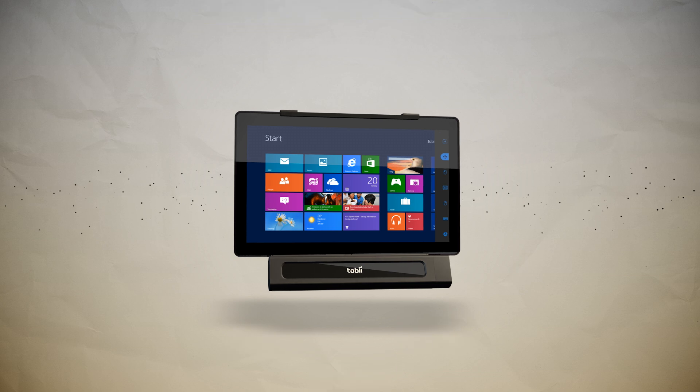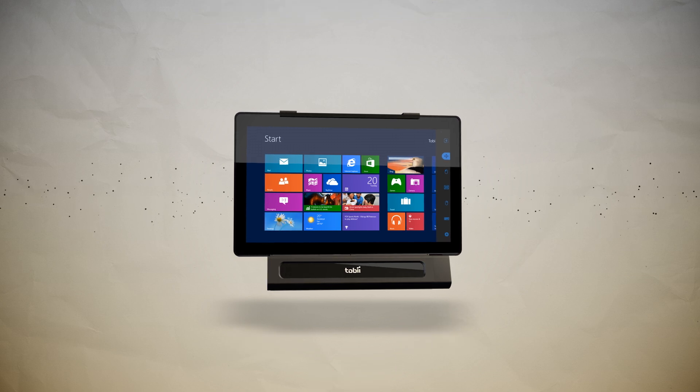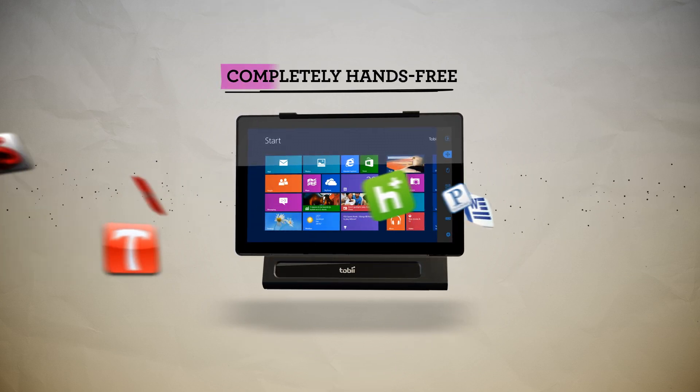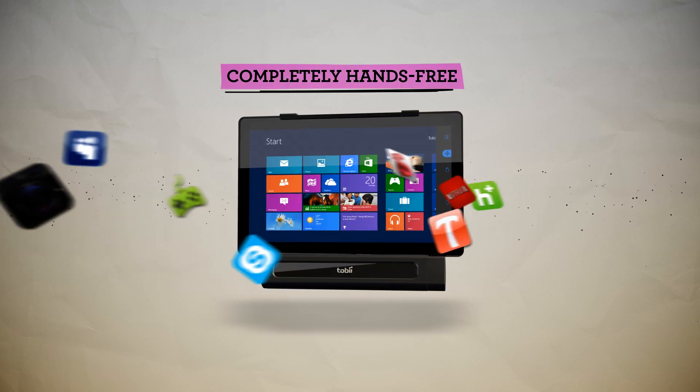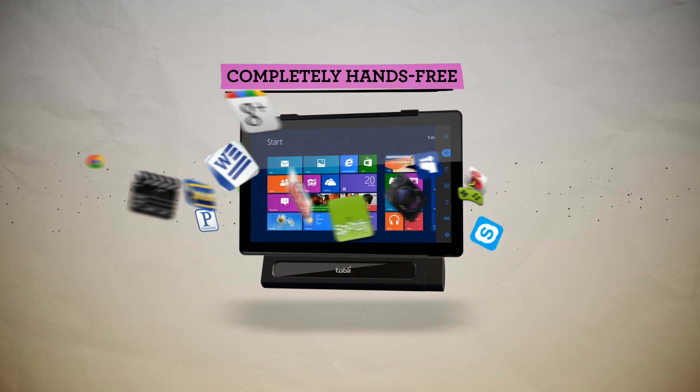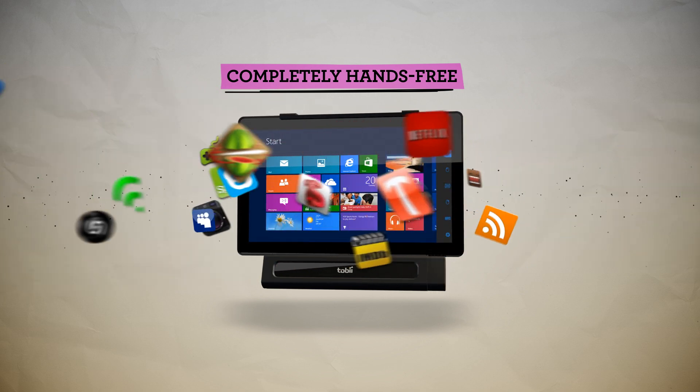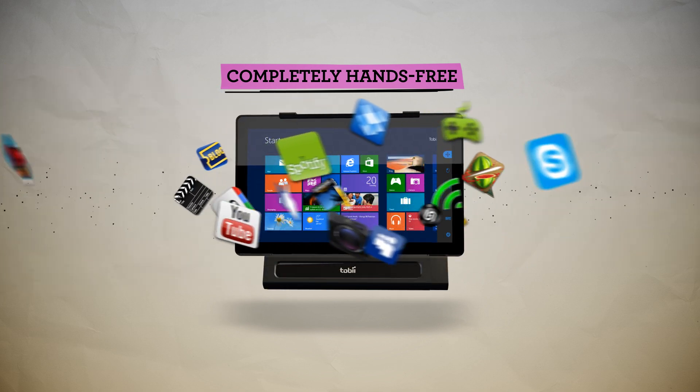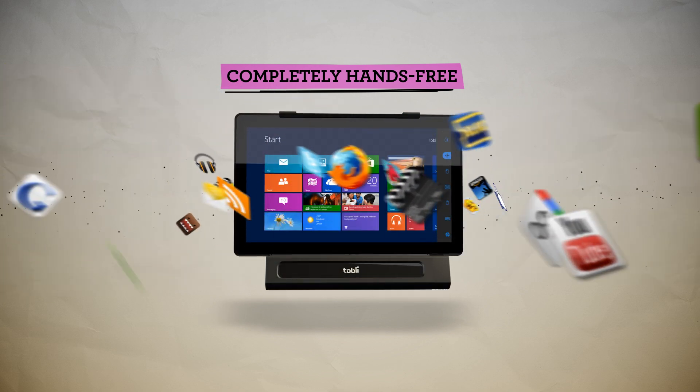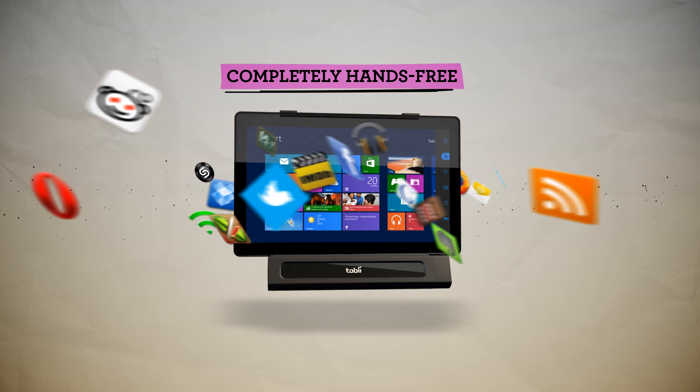The Tobii iMobile allows for completely hands-free access to Windows 8 apps, internet, movies, music, e-books, social media, games, and more.